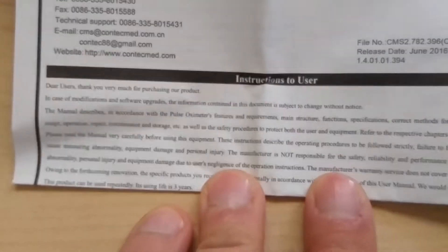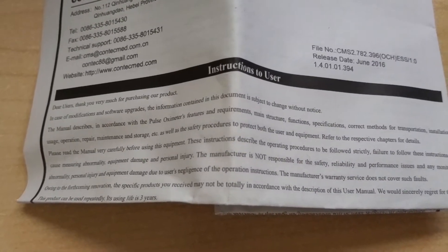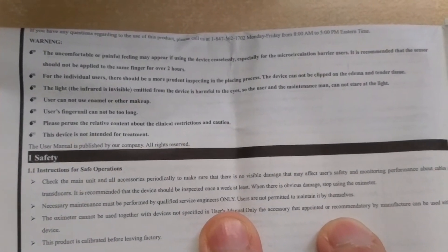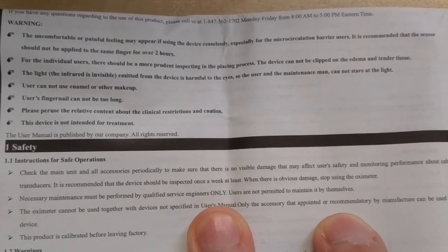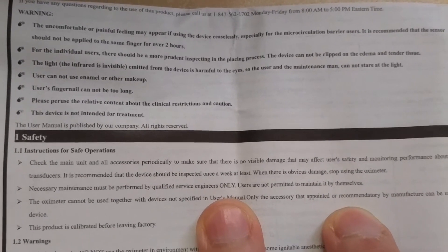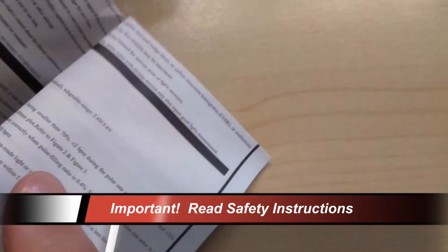You want to do this safely, so please look at the warnings in the manual to make sure you are aware of them. They basically tell you that you're not supposed to be using it on the same finger for over two hours. Also, the user cannot use enamel or other makeup, probably because it affects the accuracy, and your fingernails cannot be too long. This device is also not meant to be used for treatment, so please read through the details so you know how to use it and get accurate results.